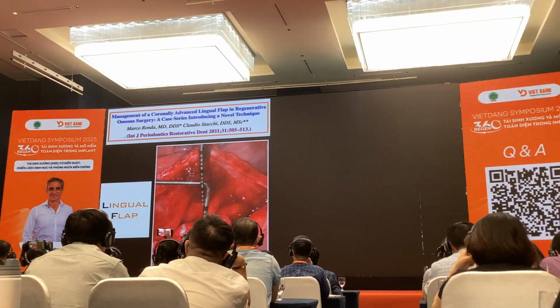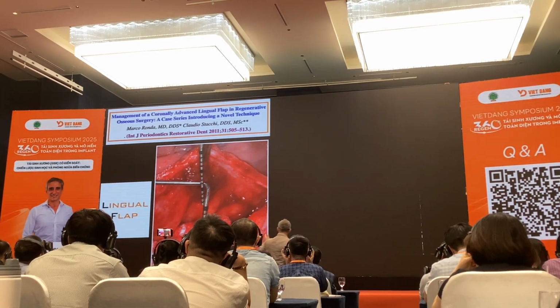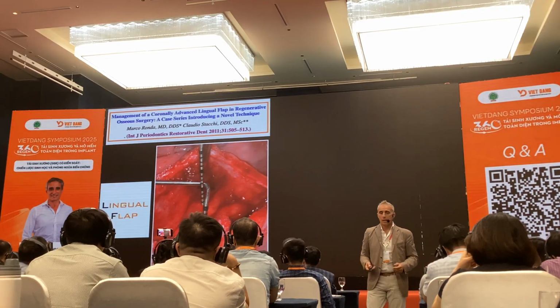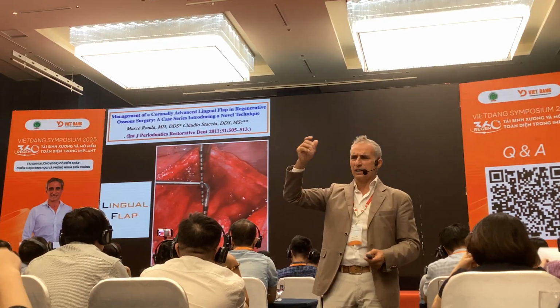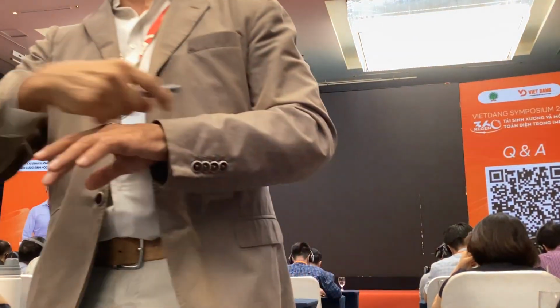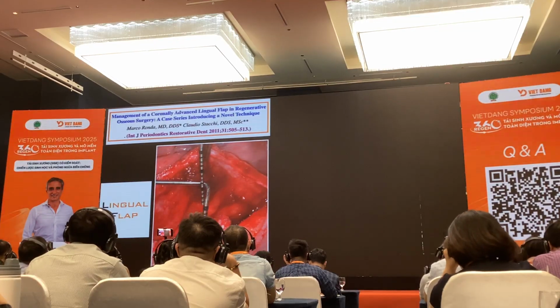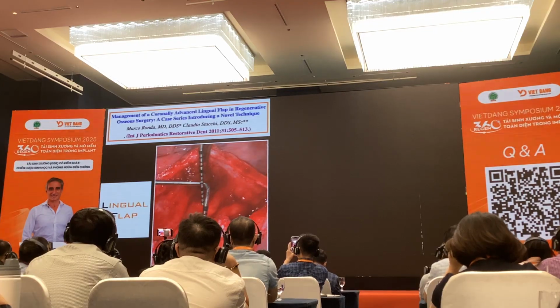It's normal. If we wanted to close this kind of regeneration, we have to passivate perfectly the flap. We could speak for a long time of all guidelines that are important in order to reduce the risk of complication. All guidelines. But then at the end, if you don't passivate the flaps, you cannot close for the first intention. And look at this is a lingual flap.